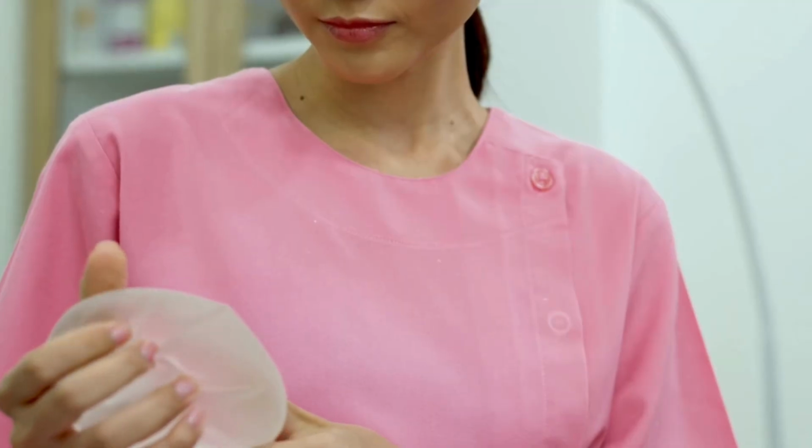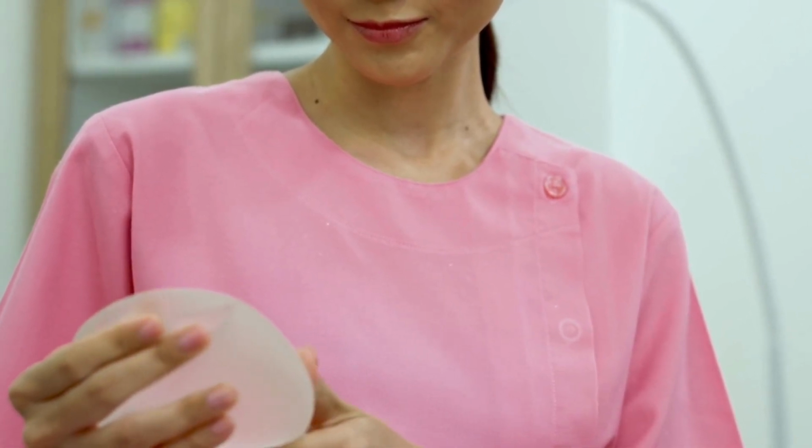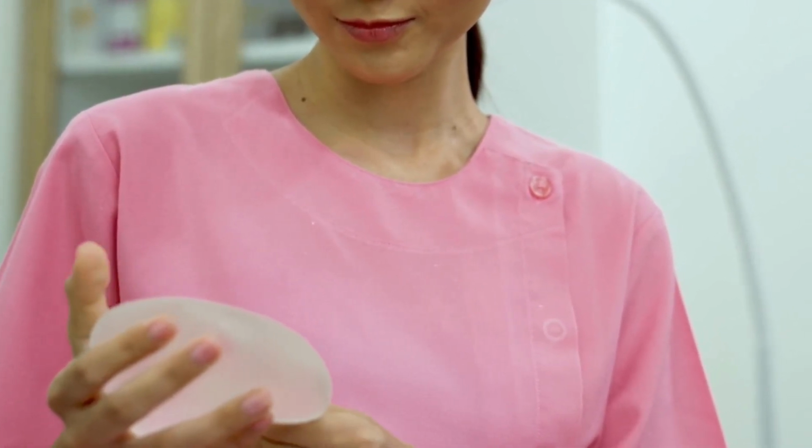There is something known as rippling or wrinkling, where you can see or feel the edge of the implant. This is especially true if you have an implant that's placed above the muscle and it's a little too large for your body frame, and you have low body fat, and you lean over, and sometimes you can see or feel the rippling or wrinkling of the actual implant or the outline over at the side near the underarm.